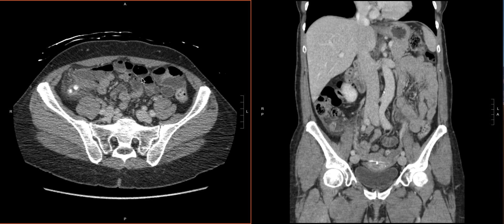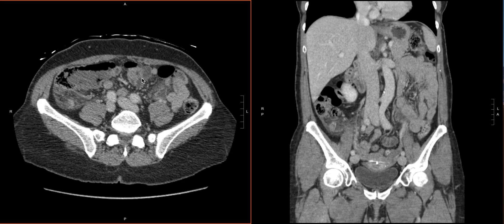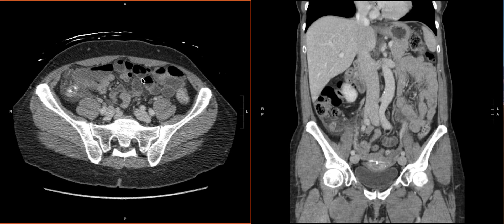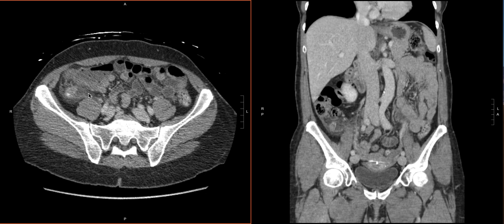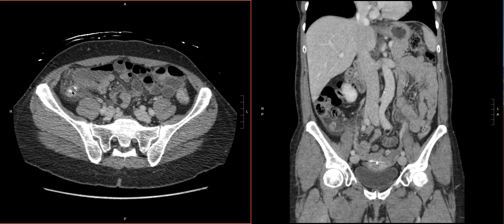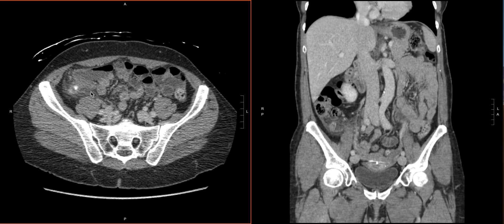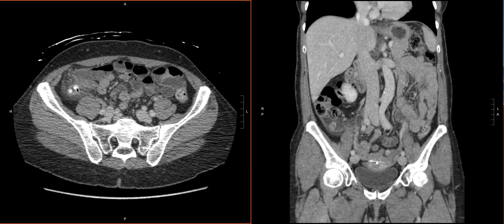There are some fecaliths or appendicoliths in there, and now we can characterize it. In the case of acute appendicitis, there's going to be peri-appendiceal inflammation a lot of the time — this is all that dirty fat, all that fat stranding compared with the clean fat over here. So there's marked inflammation. The diameter is well above 6 millimeters — it's about 1.5 centimeters — so we have a dilated appendix. The presence of these calcium deposits, the fecaliths, is oftentimes a good sign that you're dealing with appendicitis.